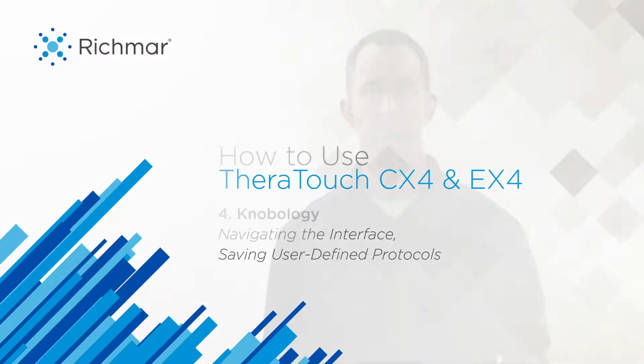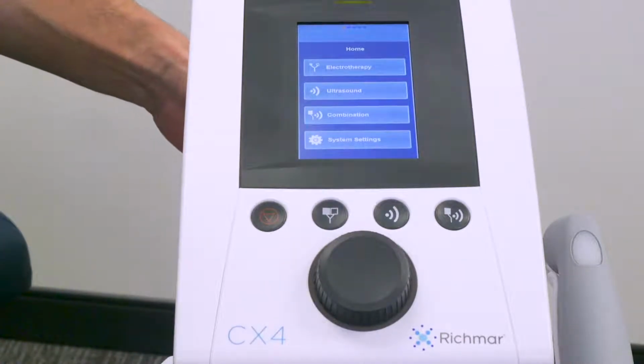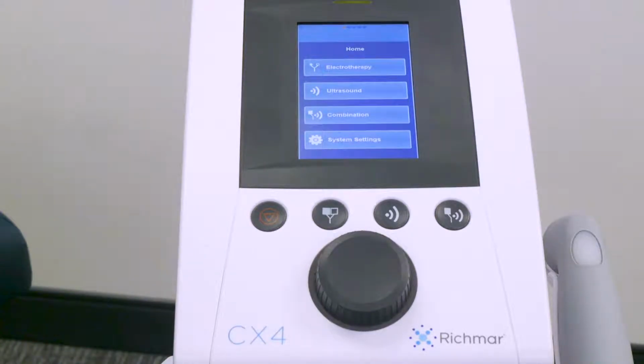In this video segment, we're going to introduce you to the basic navigation of your new TheraTouch EX4 and CX4. First and foremost, you'll want to power the unit on with the switch located on the back side of your device. Once the unit boots up, you'll see the home screen.